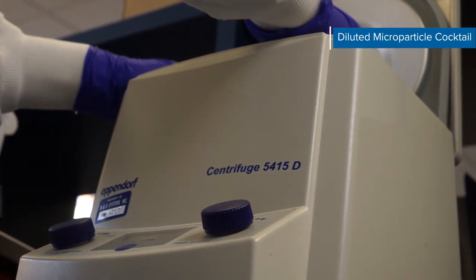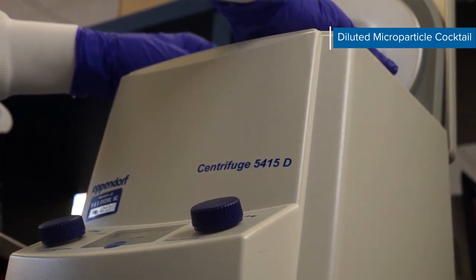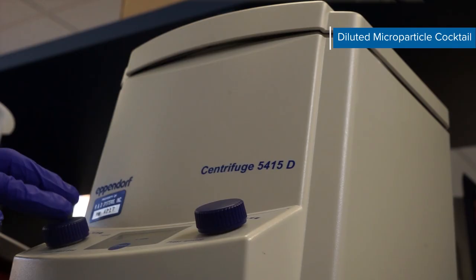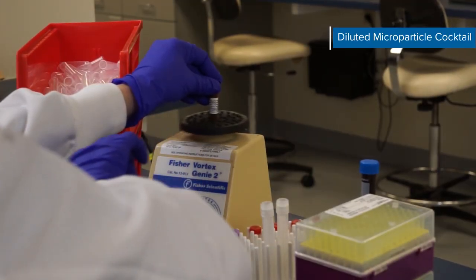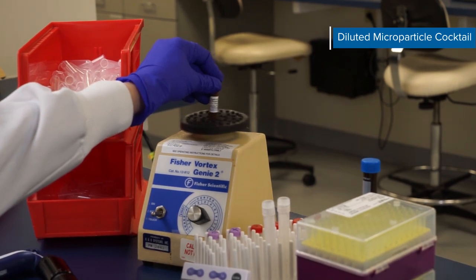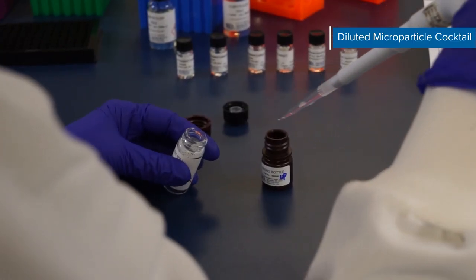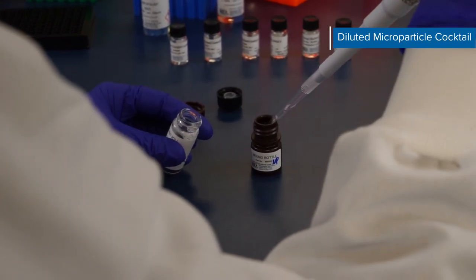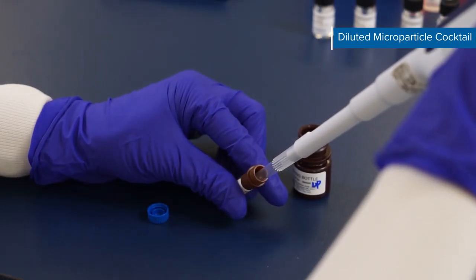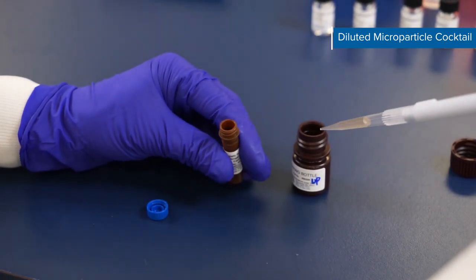To prepare the diluted microparticle cocktail, first centrifuge the microparticle cocktail vial for 30 seconds at 1,000 times the force of gravity. Then gently vortex the vial to resuspend microparticles while making sure not to invert the vial. Finally, dilute the microparticle cocktail using assay diluent RD2-1 in the mixing bottle provided. Refer to your kit booklet for specific volumes and be sure to protect microparticles from light.